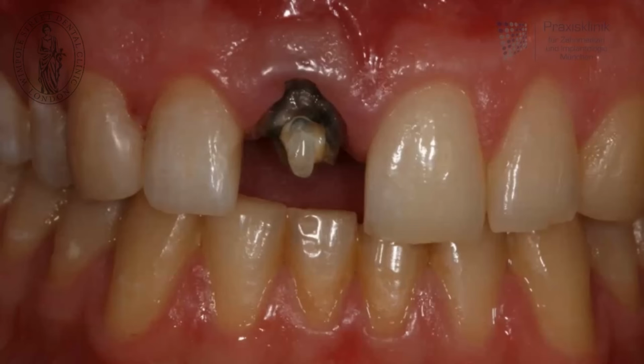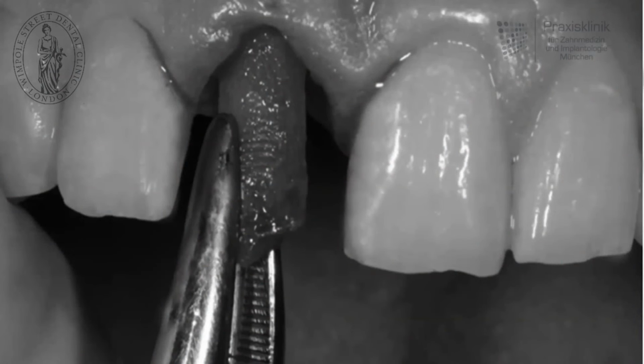Additionally, this tooth had an infection at the very tip of its root, so this tooth needed to be taken out. Of course, in the old days we took out the tooth, waited 3 months, placed the implant, waited 3 months and then placed the crown. So you had an intermediary period of approximately 7 to 8 months where you didn't have the proper tooth.